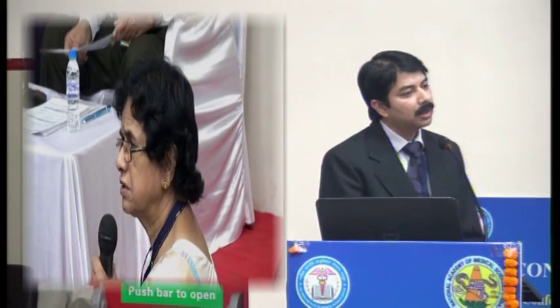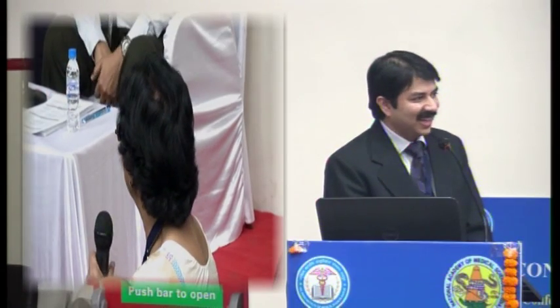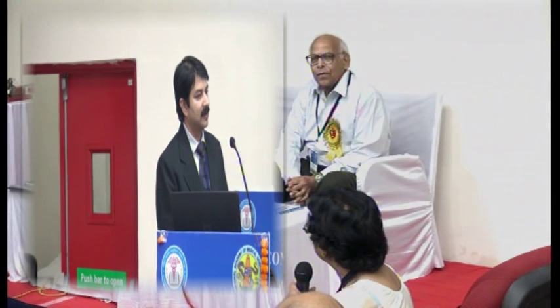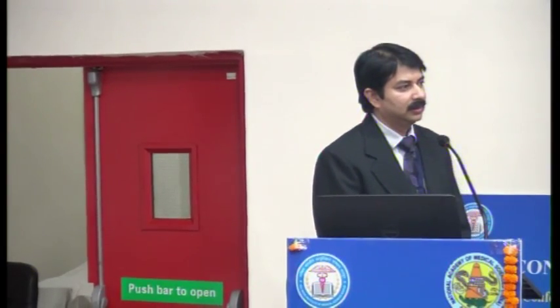How much is today's cost for these machines? Sir would know very well. I'll just mention, we had asked for a high energy linear accelerator for each AIIMS, a low energy linear accelerator, an HDR brachytherapy and a CT simulator. There was some issue with the low energy, but we are getting the remaining. So it comes between say 30 crores and 50 crores per AIIMS. If we had included everything, it was going to come to approximately rupees 50 crores per AIIMS. Every AIIMS was to get one set.